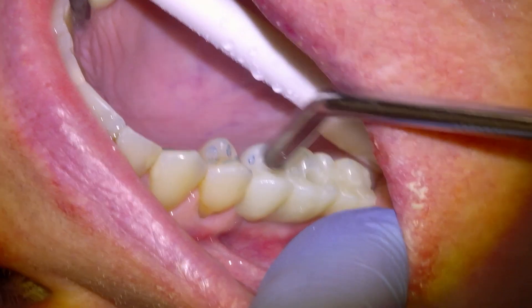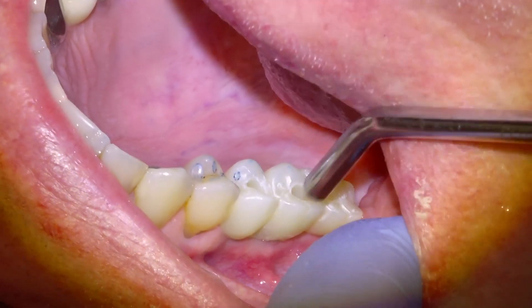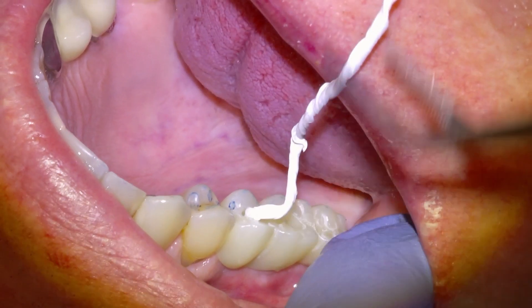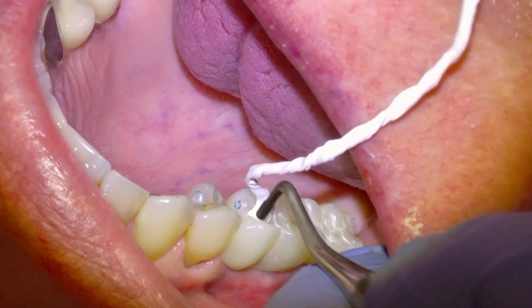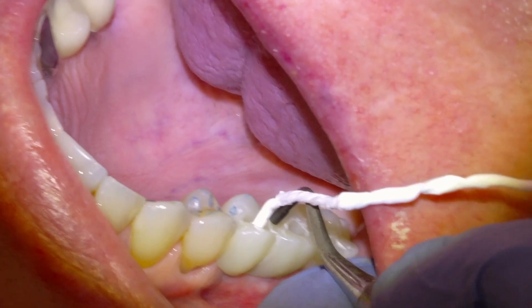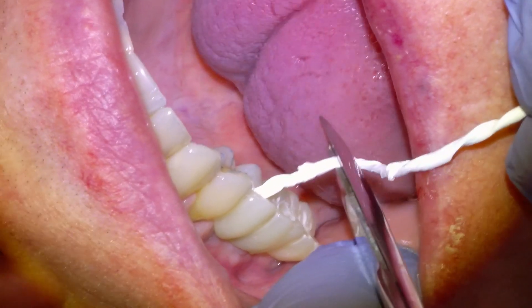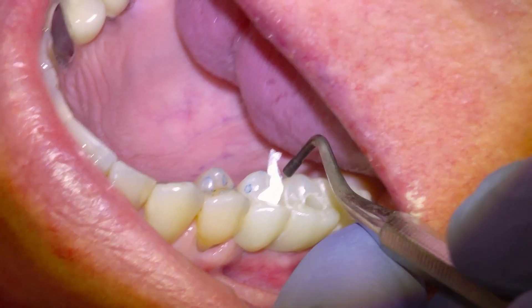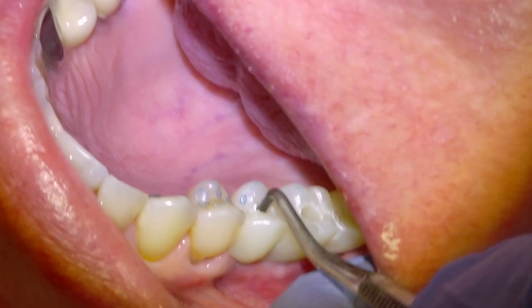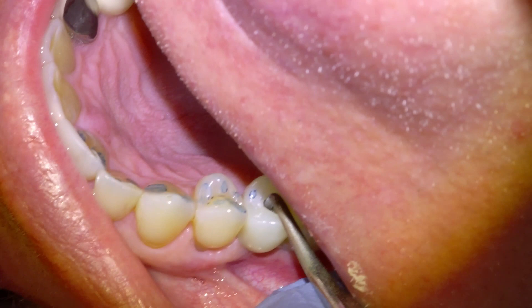Once we've made any adjustments to the bite, we will dry out the screw channels and then start to plug them up. We actually put in some teflon tape first to cover up the screw head, so that if we ever need to access the screw to remove the bridge, we can just drill into the screw channel and remove the teflon tape to access the screw. We pack it in with a little packer instrument and do that for both screw channels.